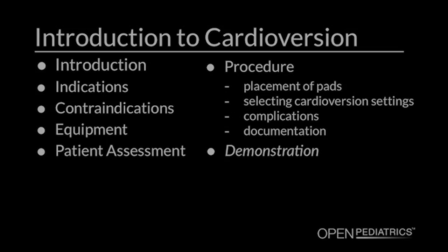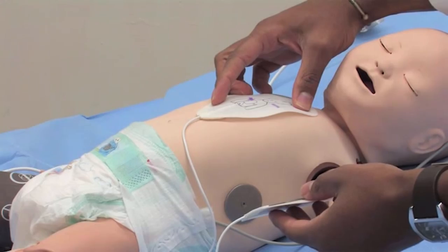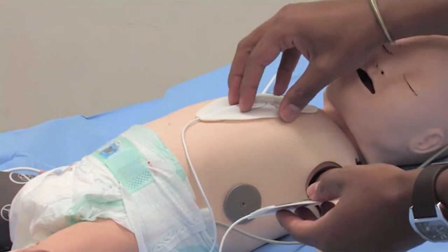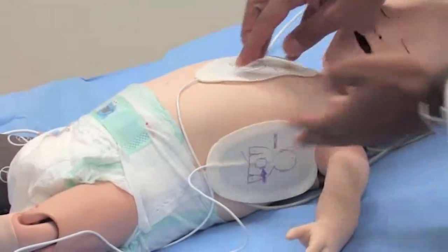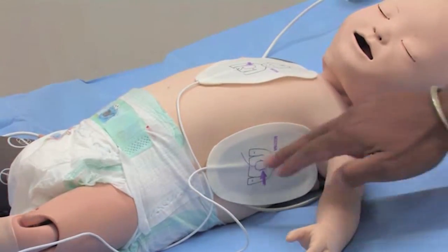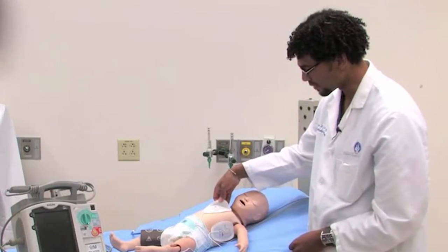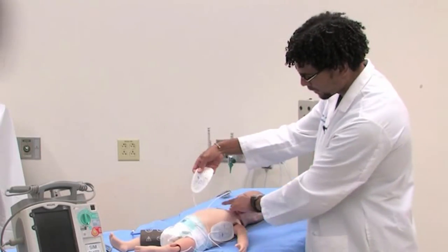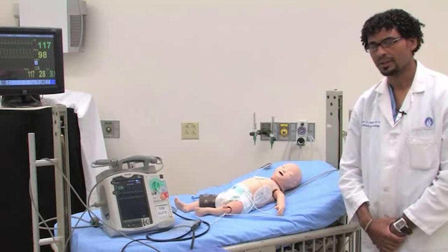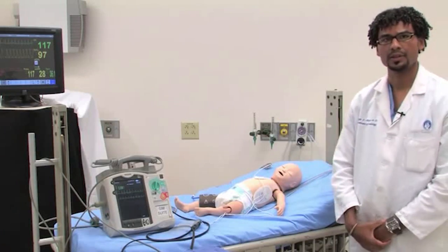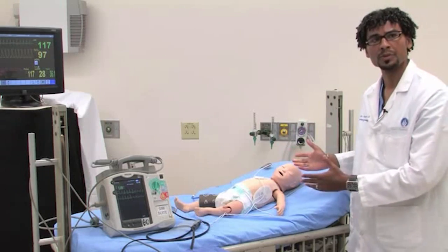During our simulation, I'll place the pads in front of the patient over the approximate area of the right ventricular apex and the second pad in the anterior axillary line where the approximate posterior base of the left ventricle is. The mannequin is only able to sense the electrical activity when the pads are placed in very specific positions. In the simulation, we have a 10 kilogram infant that has presented to our ICU, in whom we will demonstrate our algorithm.